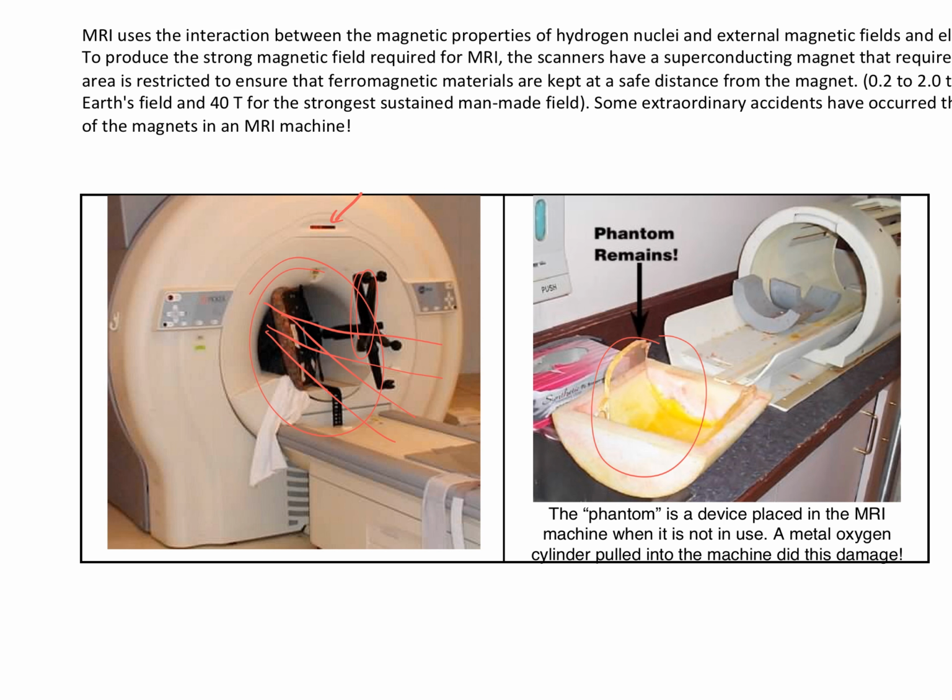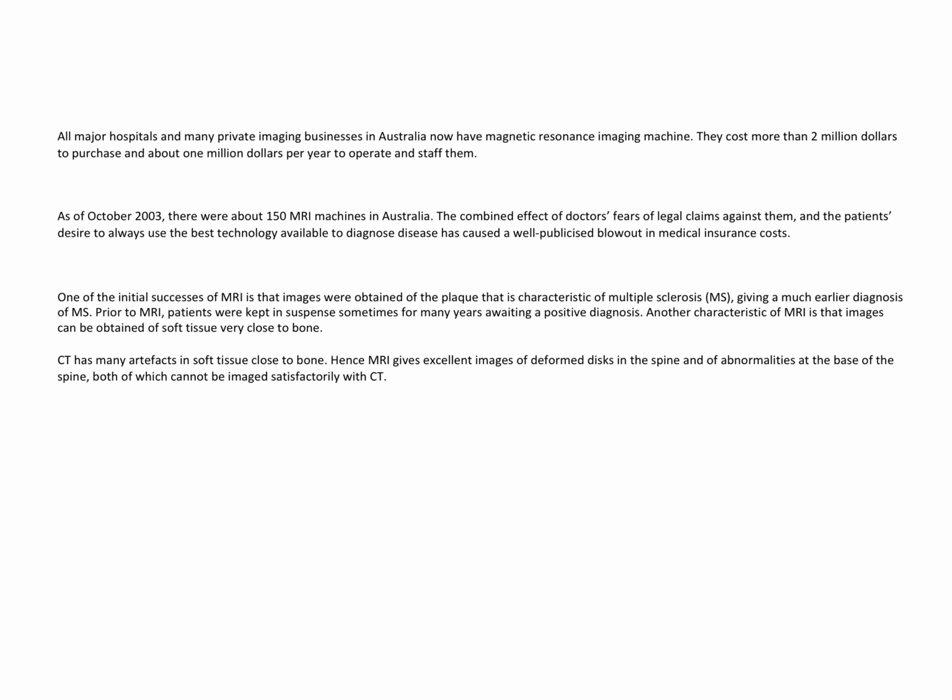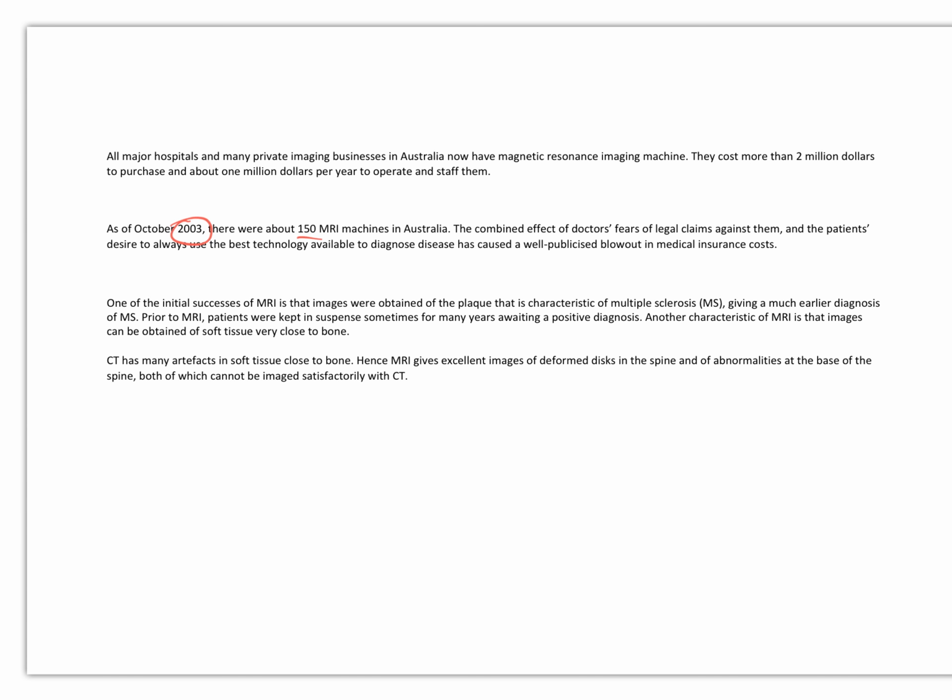The machine also has indicators and is connected to the internet to keep track of coolant levels, often liquid helium, which has to be monitored in order to create a very powerful magnetic field. Major hospitals all use MRI machines. A lot of private practices also use them, and private clinics. You can see this is quite a long time ago, but there were quite a few machines, so there's now a substantial increase on that number.